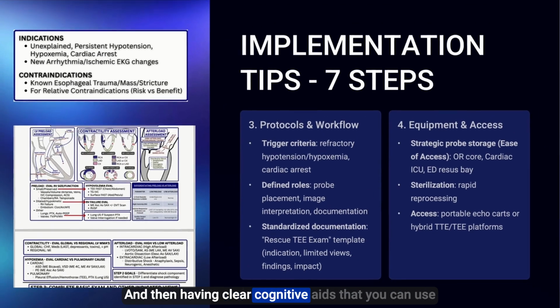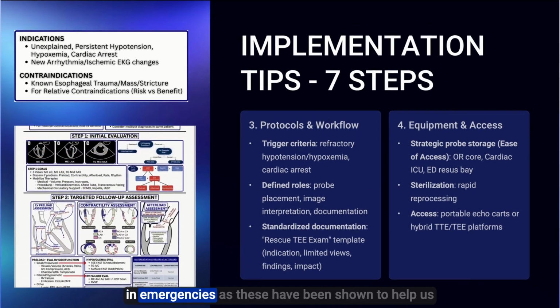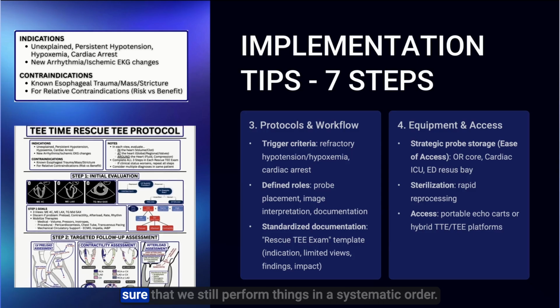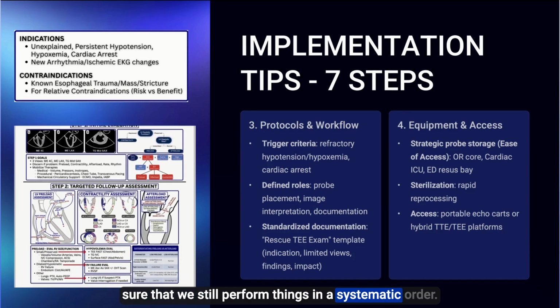And then having clear cognitive aids that you can use in emergencies, as these have been shown to help us in things that we forget in stressful situations to make sure that we still perform things in a systematic order.